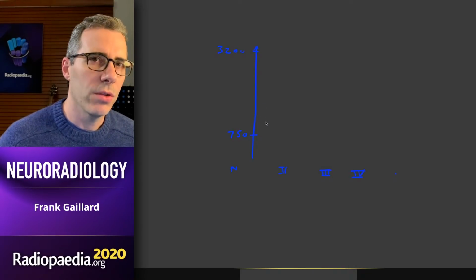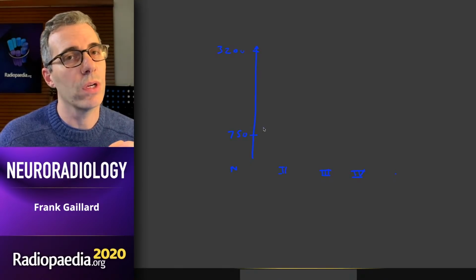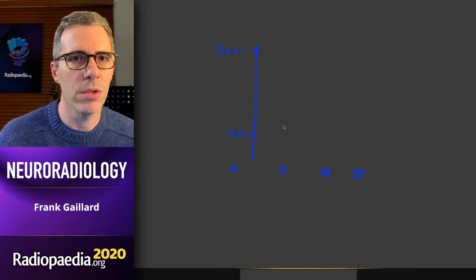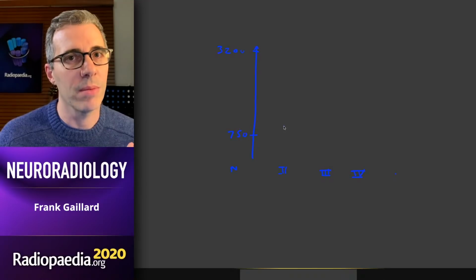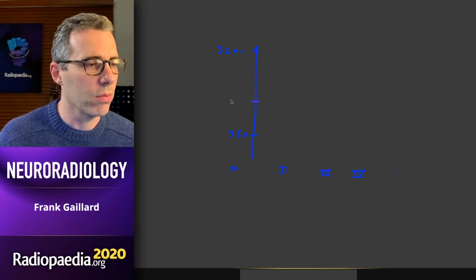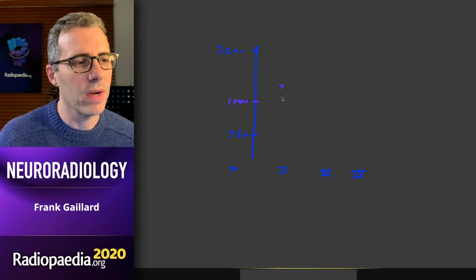So if we're talking about a grade 2 tumor, grade 2 tumors are unable to get rid of interstitial fluid as well as normal brain is. So they accumulate more fluid, which is why they're bright on T2 and why they exert positive mass effect. The positive mass effect is not really because of the extra cells. I mean, there is a little bit, but it makes up a tiny fraction of the overall mass effect. And so because there's extra fluid, what we see is an increase in ADC values. And we'll put an arbitrary number of 1,000 here. And so grade 2 will tend to be around 1,200.